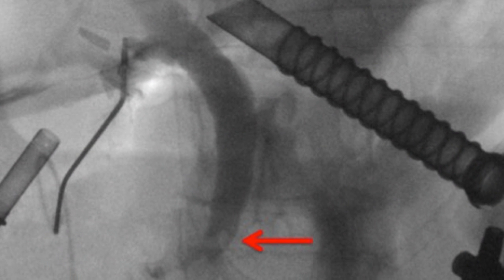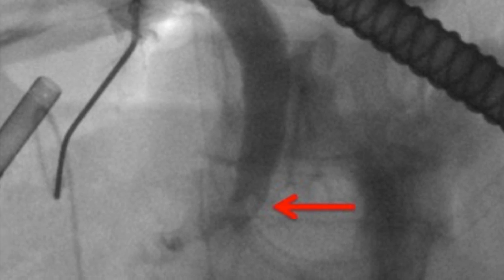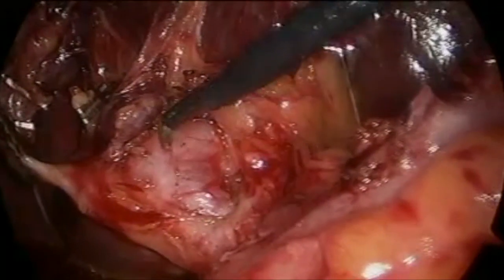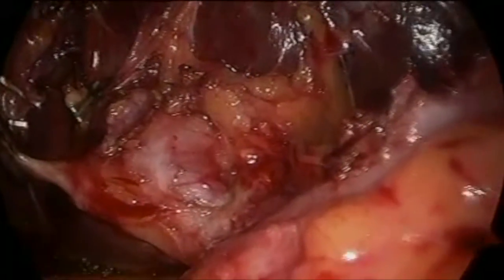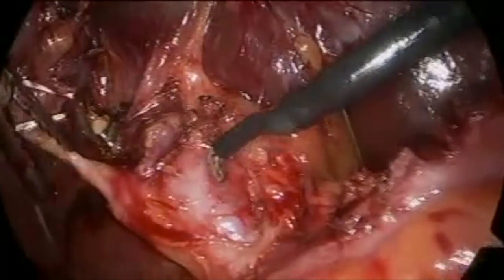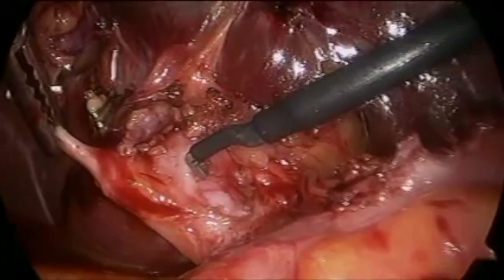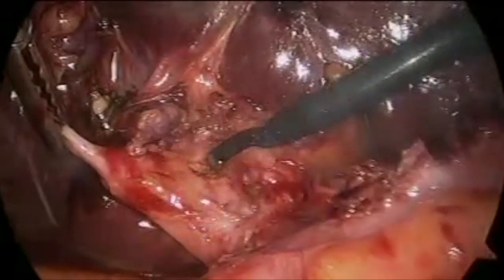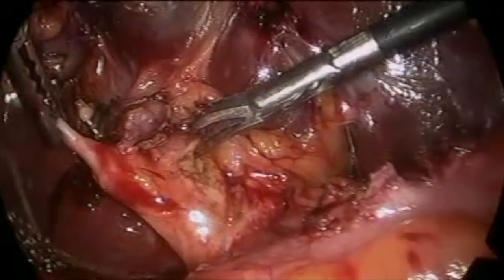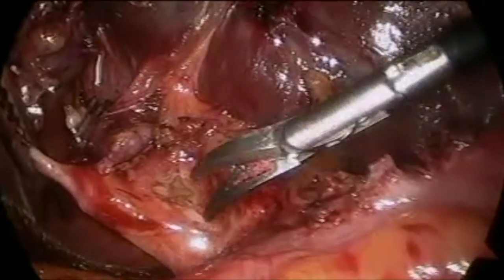This demonstrates a filling defect in the distal bile duct that is non-mobile, consistent with the MRI images. I proceeded to clean off the anterior surface of the junction of the common hepatic duct to the common bile duct, and then using cautery on cut, a small ductotomy is made and extended longitudinally using Metzenbaum scissors.